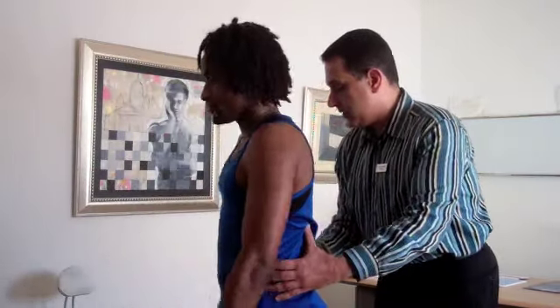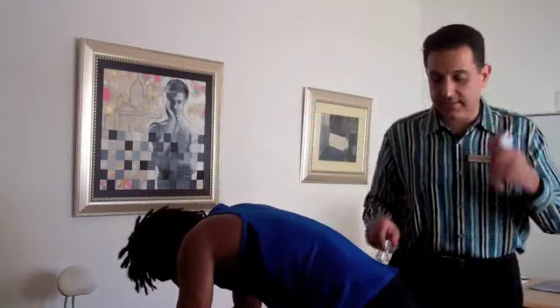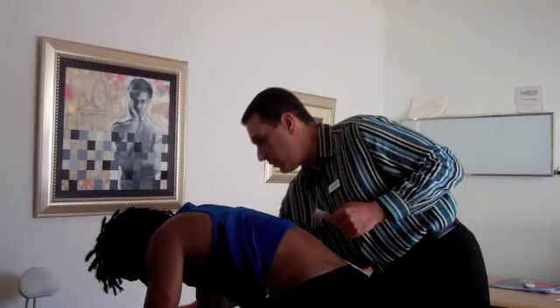So we'll have the patient stand up. Go ahead and patient stand up. I'm going to have you just turn, and you'll bend forward for me and touch the table. I've had the tape sections already pre-cut, and we're going to tape the area for support for lower back pain.